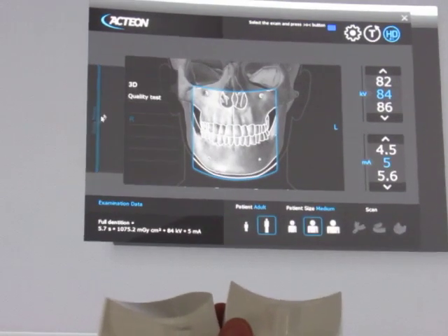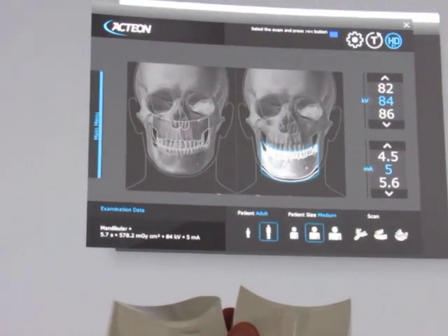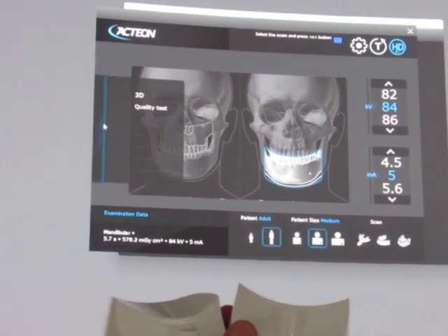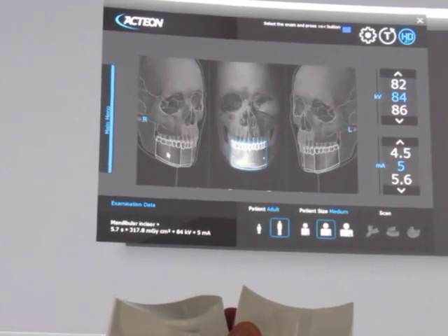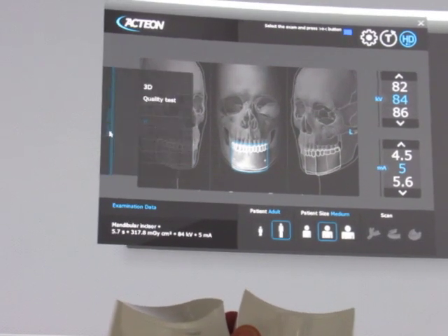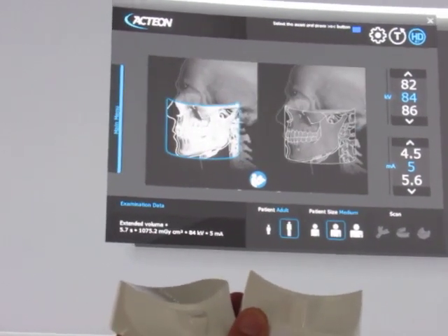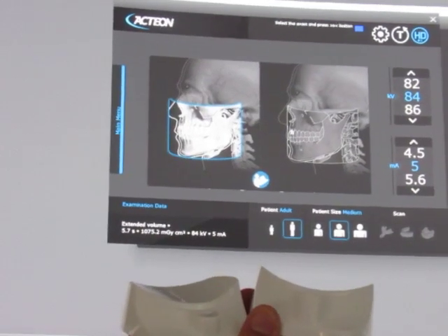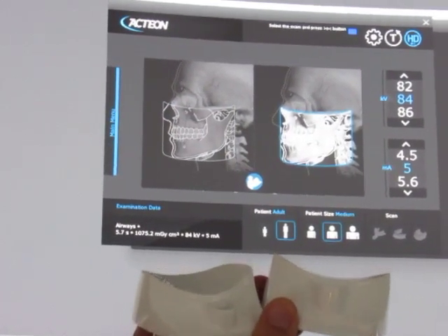Next, you would use this for your single jaw mandibular. You will also use this for mandibular teeth, which there's five shots. Extended volume, which is your 12 by 10 dentition shot, and your airway capture — you will use either chin rest.